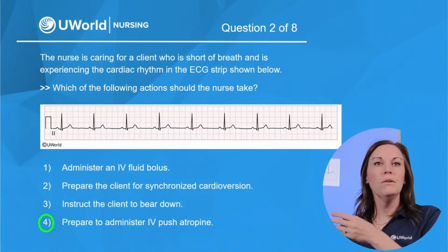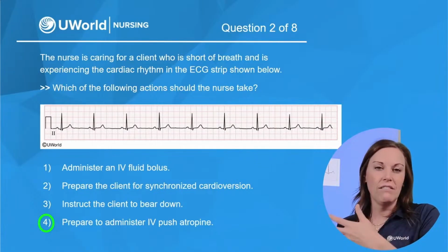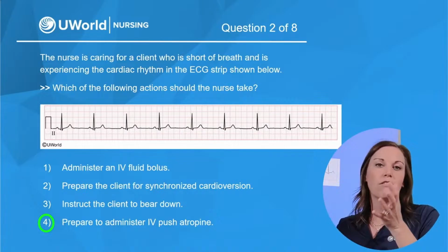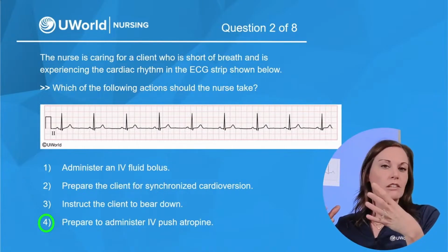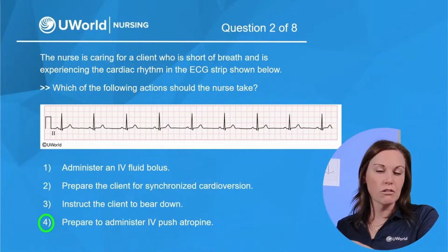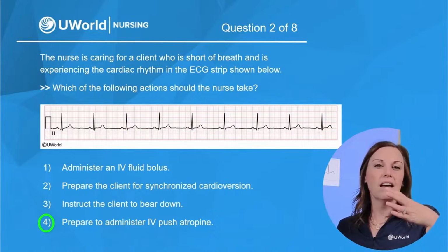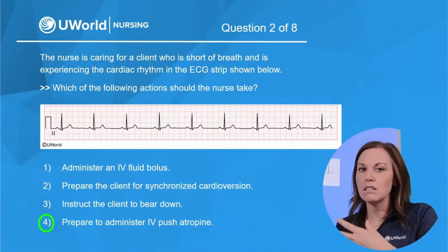And again, what we see in that PR interval is the electrical activity, the power or energy needed to squeeze our atrium. So you're moving blood from the atrium to the ventricle, but our ventricles are responsible for perfusing our body. So that conduction that needs to happen needs to be a lot more significant.